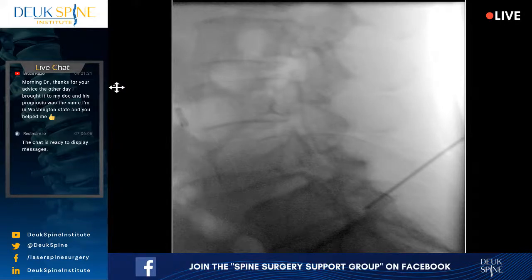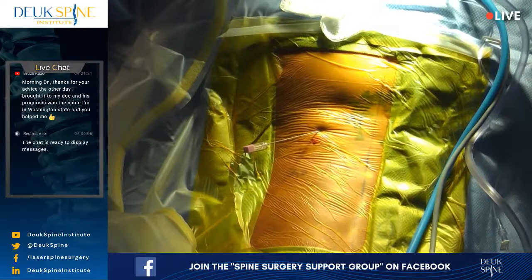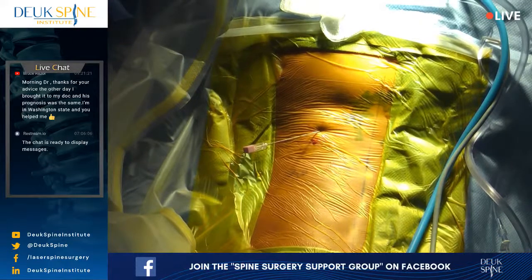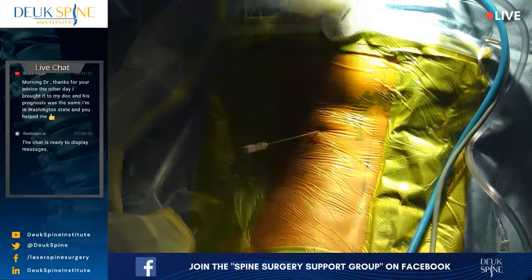I almost feel like we have to change the arc. Why don't we come further south? Just to line it up better. Okay. That looks pretty good on the lateral view.